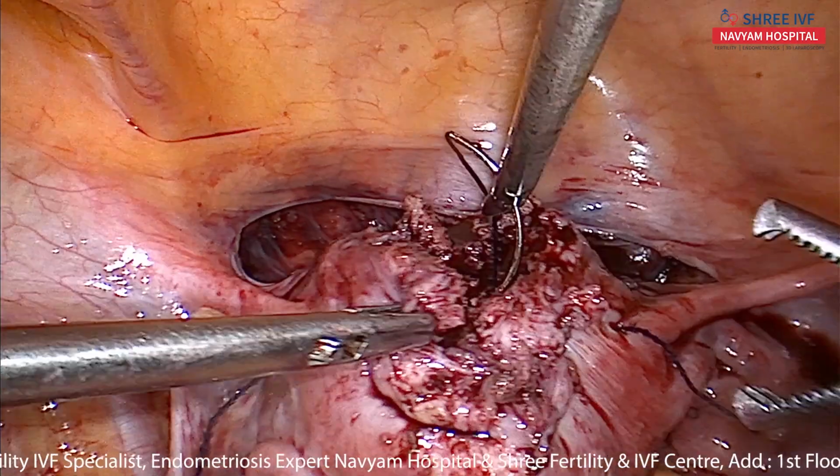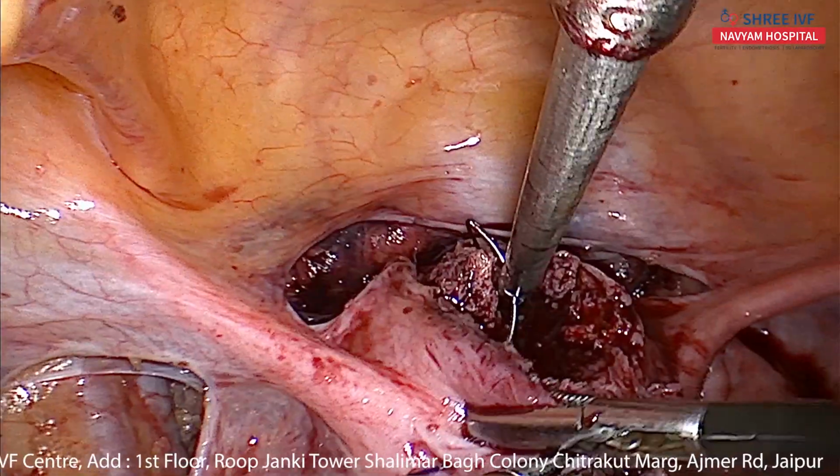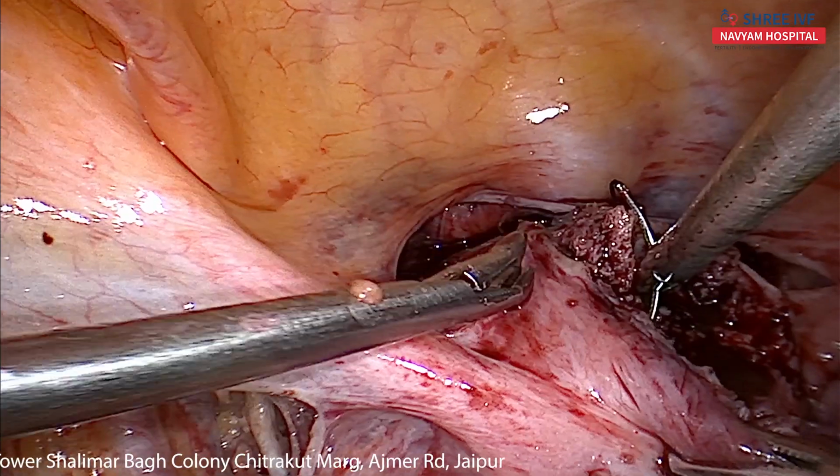And this is the defect, and we have to take a very deep suture here.